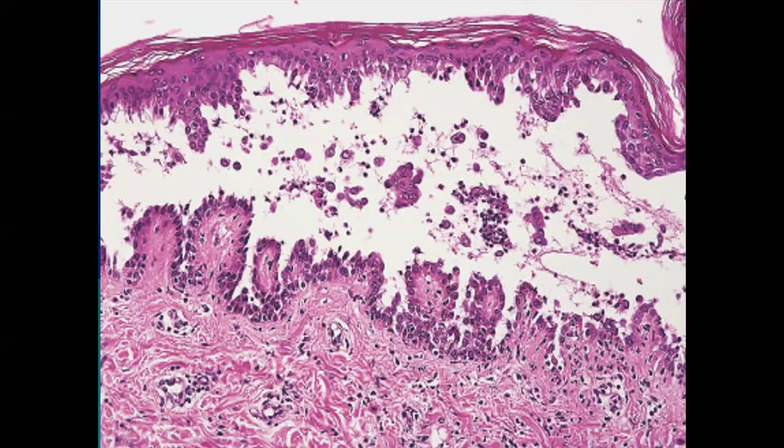On biopsy, you would find a suprabasal blister, and there is acantholysis. Epidermis is distorted. Lots of acantholytic cells are seen within the blister cavity. The basal layer is still attached to the hemidesmosomes, but there are gaps between the basal keratinocytes, and this appearance is called tombstones. The inflammatory cell is not typical of the pemphigus group of diseases. There can be inflammatory infiltrate comprising of lymphocytes, neutrophils, or eosinophils, or it can be inflammatory cell deficient.